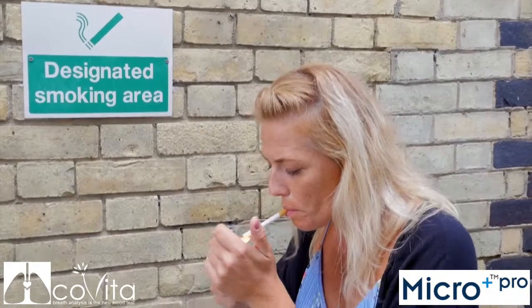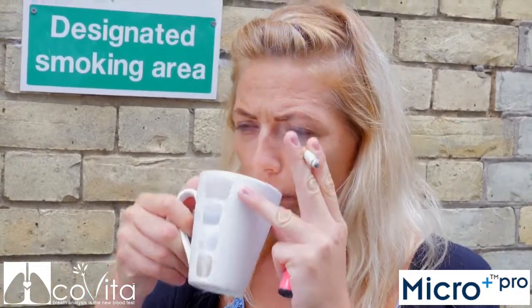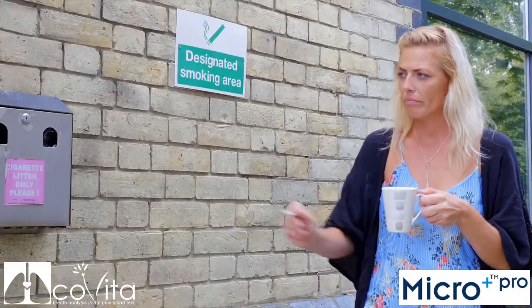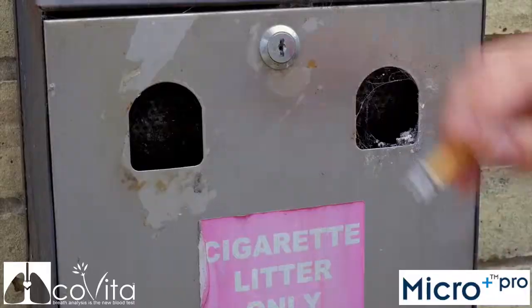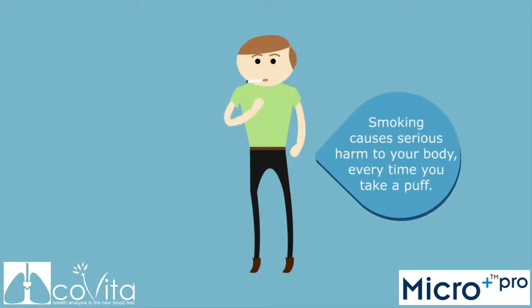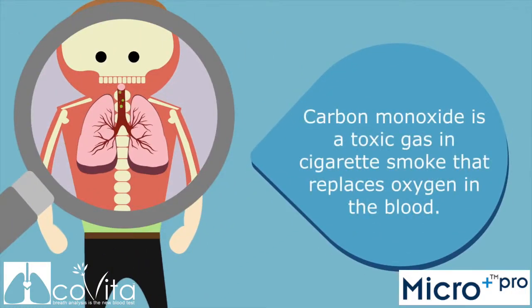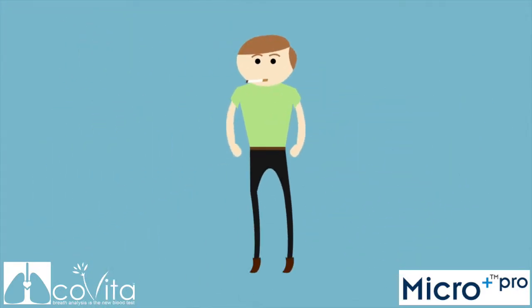Carbon monoxide is known as the silent killer because it is an invisible, tasteless, and odorless gas that is formed from incomplete combustion, such as house fires, car exhaust fumes, and smoking. Oxygen is carried around the body by red blood cells, and when you inhale smoke from a cigarette, the CO is absorbed into your blood through the lungs.